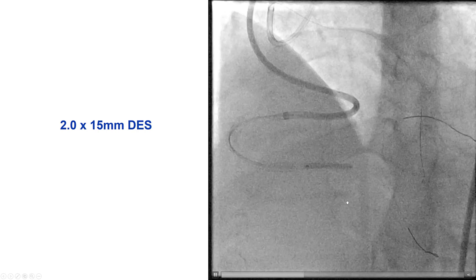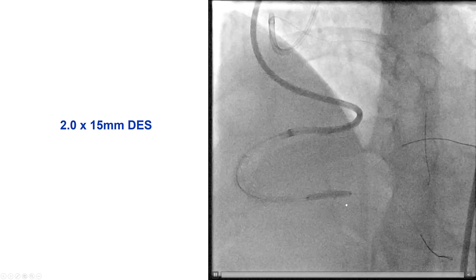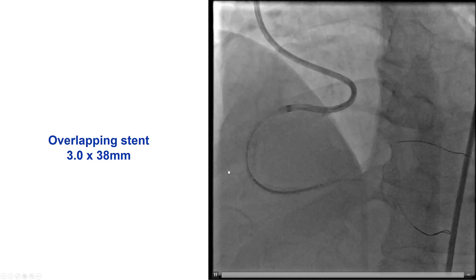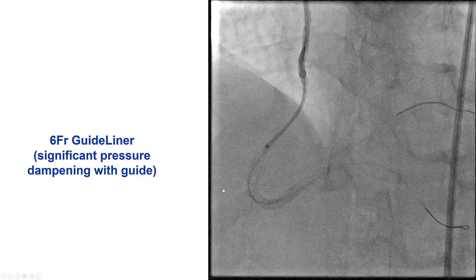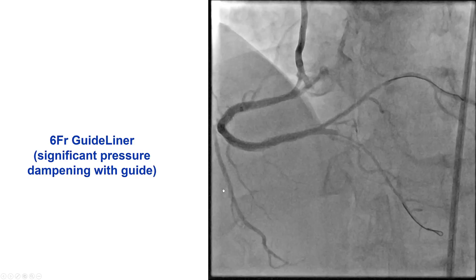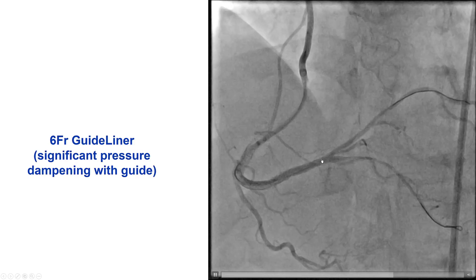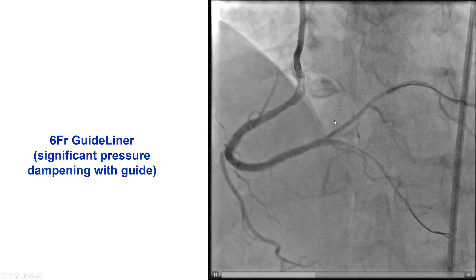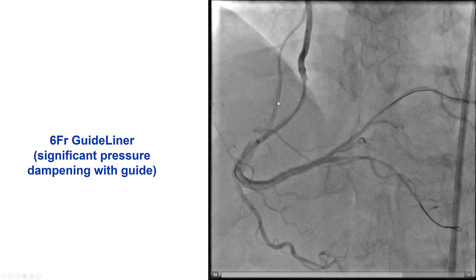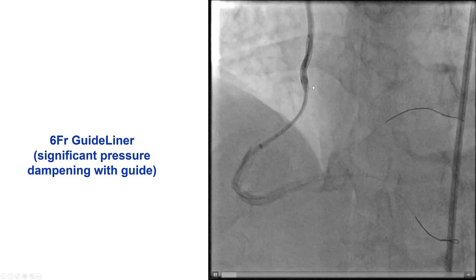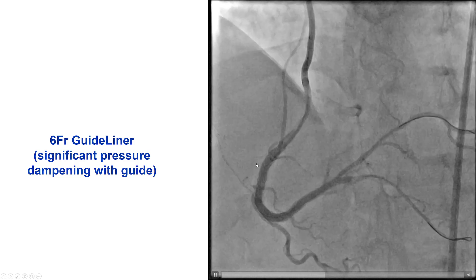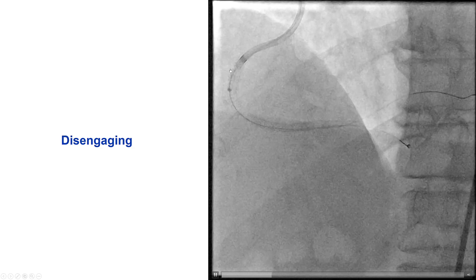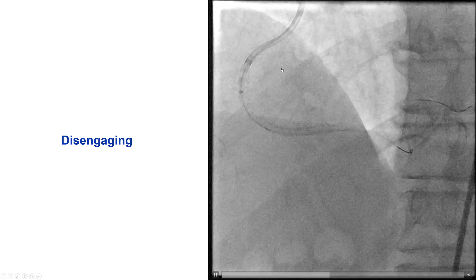We placed a stent immediately proximal to the bifurcation of the PDA and posterolateral, and then overlapped it more proximally with a 3.0 by 38 millimeter drug-eluting stent. That provided a nice result. We still had some diffuse disease into the PDA, and there was some pressure dampening, which is why we used a guide extension inserted into the RCA and disengaged the guide catheter.